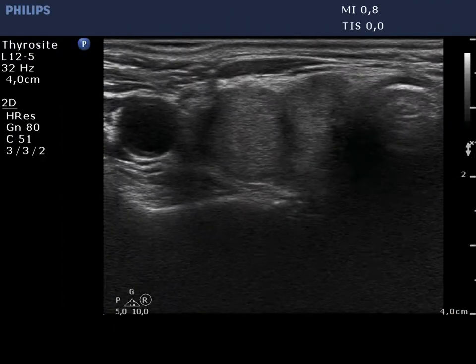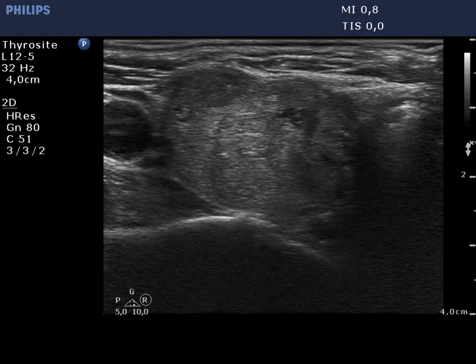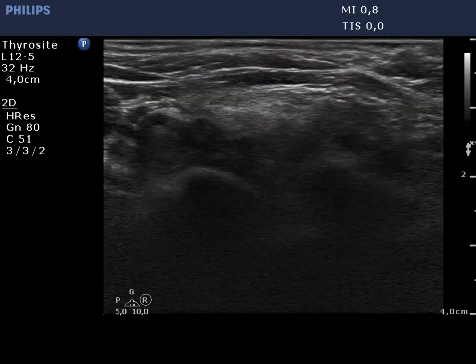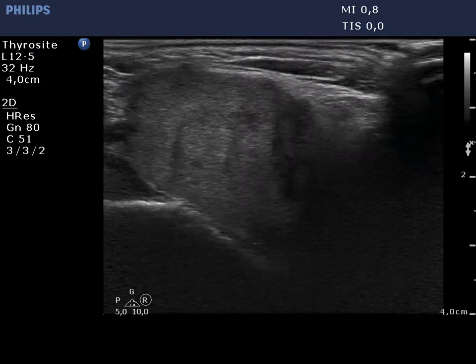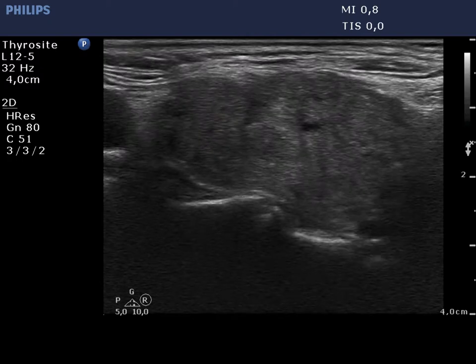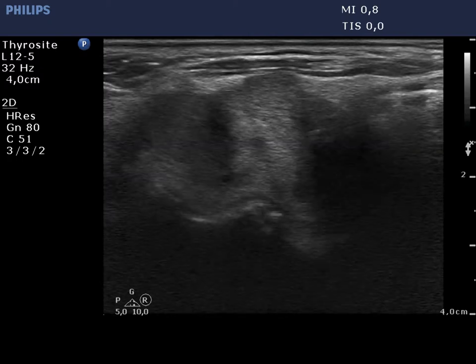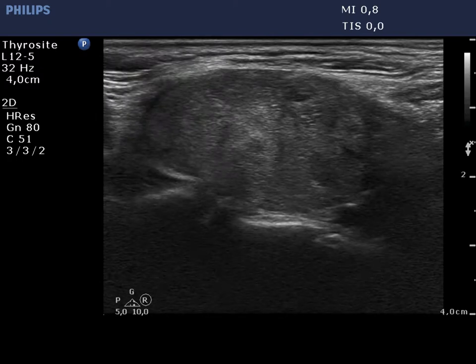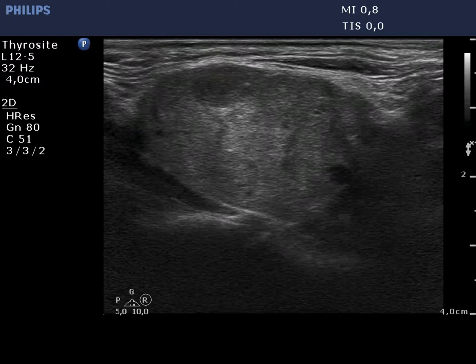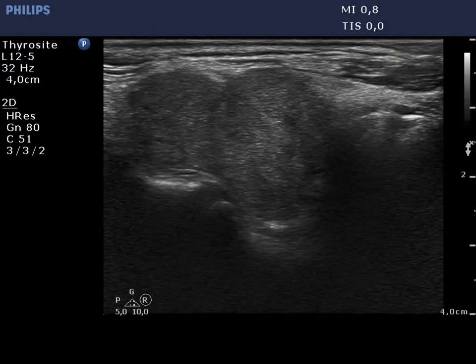The thyroid is hypoechoic and is surrounded with a relatively thin echonormal rim. This makes an appearance as if the thyroid were composed of a large hypoechoic nodule. However, the echonormal rim corresponds to thickened connective tissue.